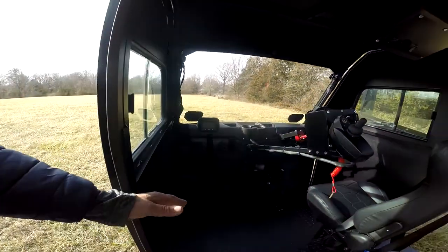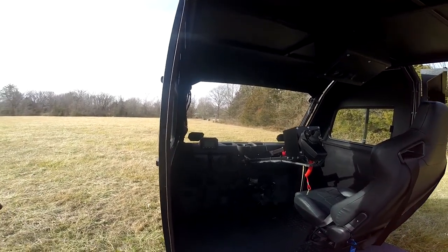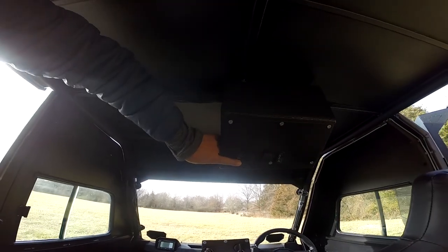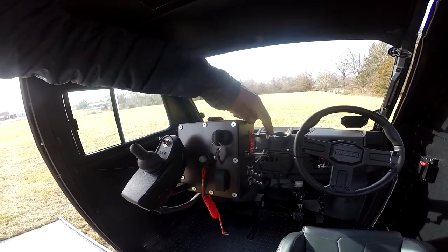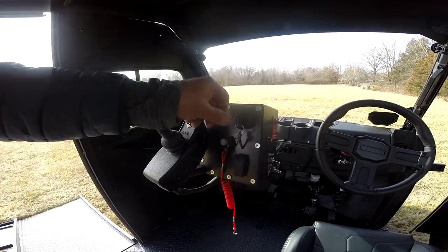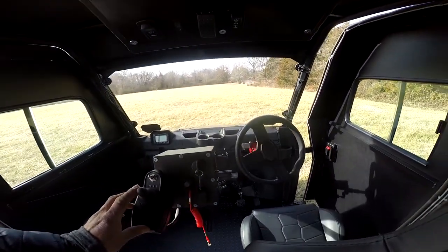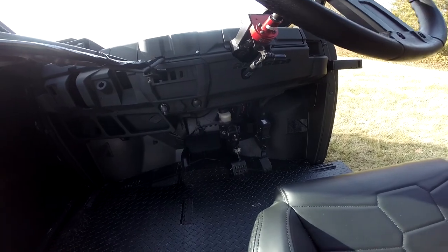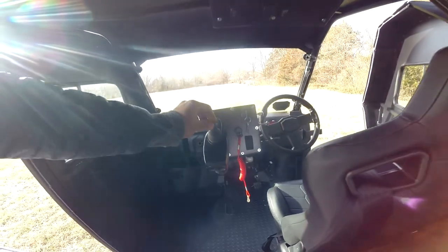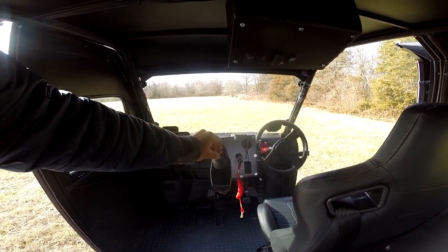This individual is reclined back, so he has better use of his chair. All the control panels are either above his head or right here. There is also a kill switch, a throttle governor, another kill switch, and these buttons here operate the joystick. The braking and the throttle are controlled by the joystick.